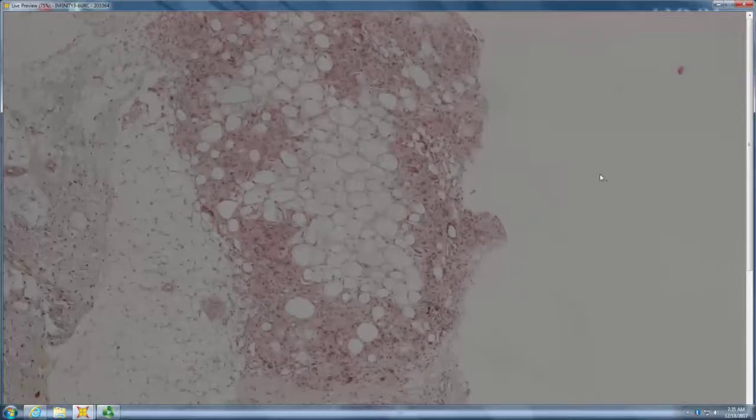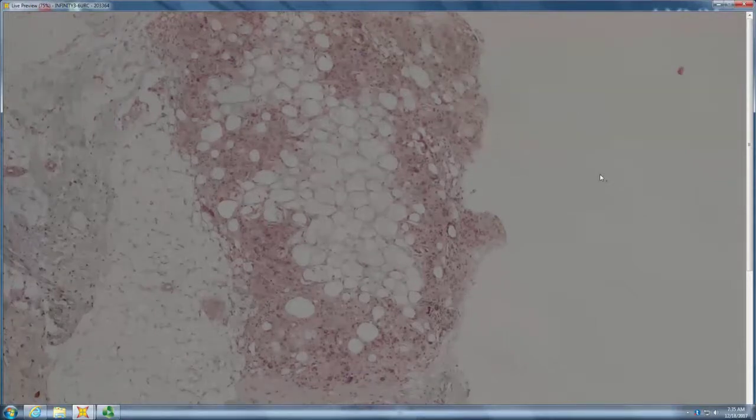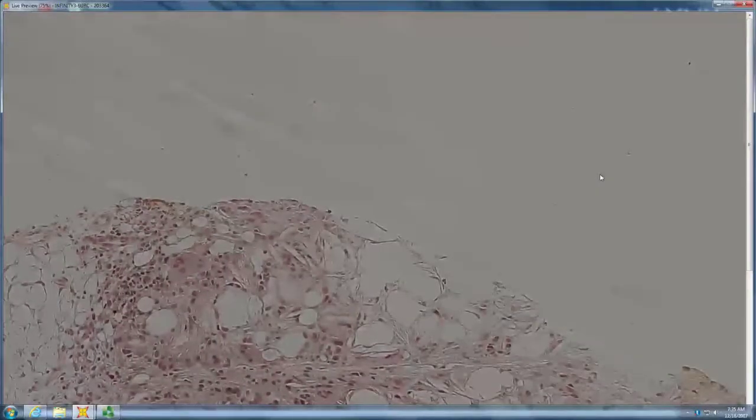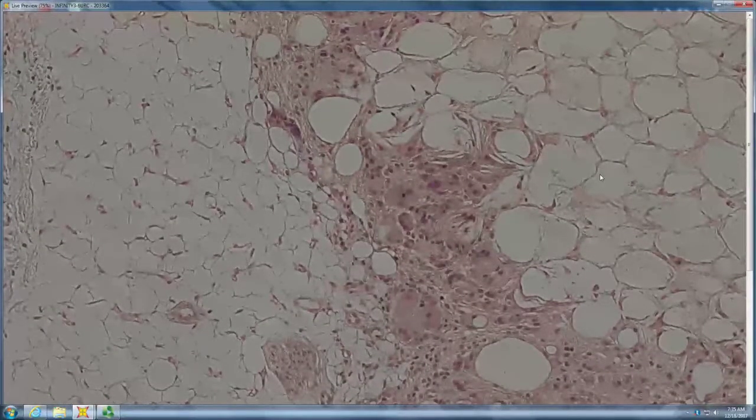Go ahead and get your eyeballs in. Some granuloma, maybe some rosettes. Yeah, so there are definitely some crystalline rosettes. And you see them better if you flip your condenser down. Increases refractility and you make out those little rosettes. So you're thinking what? Probably subcutaneous fat necrosis. What else does rosettes? Substeroid. Yeah, steroid fat necrosis and subcutaneous fat necrosis are the biggies to do that.